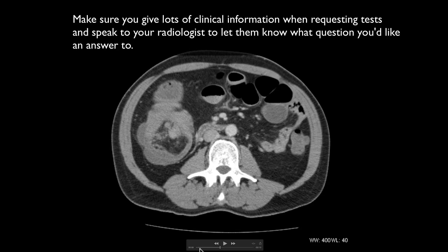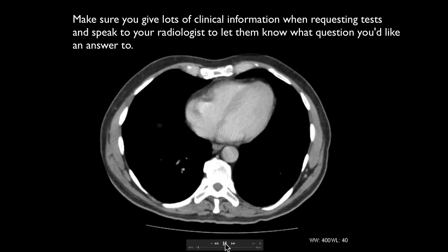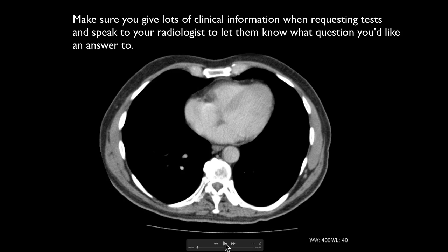Radiologists are always going on about how we like clinical information, but it is critical, because you will tailor the type of scan depending on what the question is. When you're asking for a scan, what we want to know is what is the question you need answering. We touched on this in terms of having special preparation for the bowel. But say we were worried about bowel ischemia or some arterial problem, then we'd definitely include an arterial phase on the scan. Say if you're worried about GI bleeding, for example, you'd certainly include an arterial phase. So timing the intravenous contrast is a big thing.